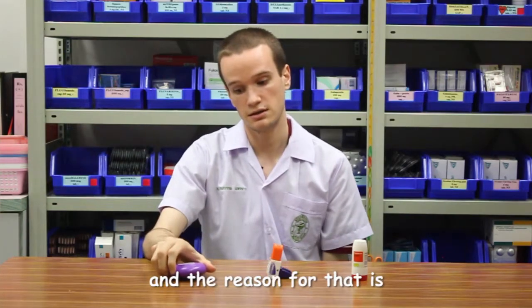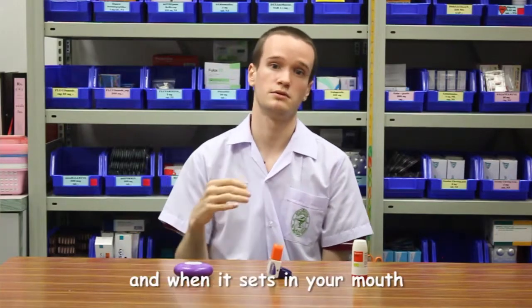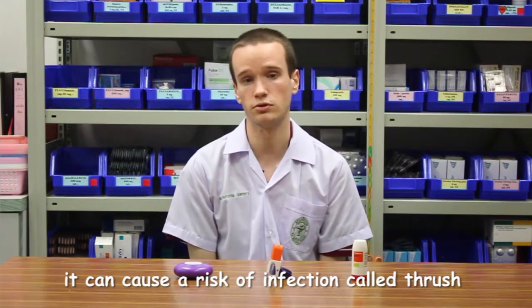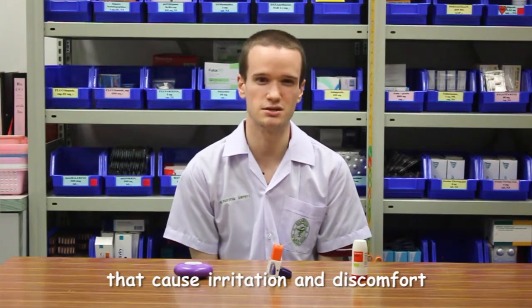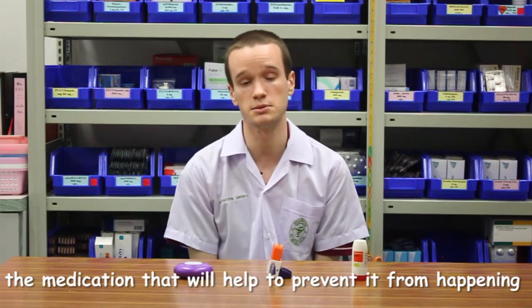And the reason for that is the medication here is a steroid, and when that sits in your mouth, it could cause the risk of getting an infection called thrush. That's a fungal infection in the back of your throat that causes irritation and discomfort. And if you wash your mouth out after you're done using the medication, that helps to prevent it from happening.